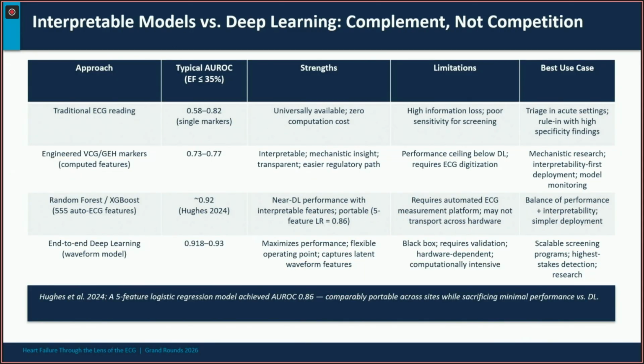So pretty much putting it all together, along the lines of information extraction: we know that with our traditional markers, we dismissed a lot of information, so their performance is not that good. But once we start putting more markers together, we get more information, and the performance goes up. And when we throw everything in the sink into these AI models, the performance is pretty good.